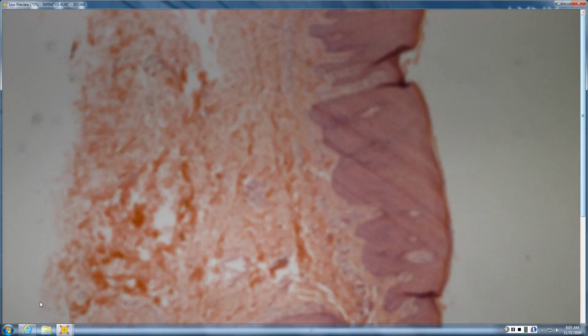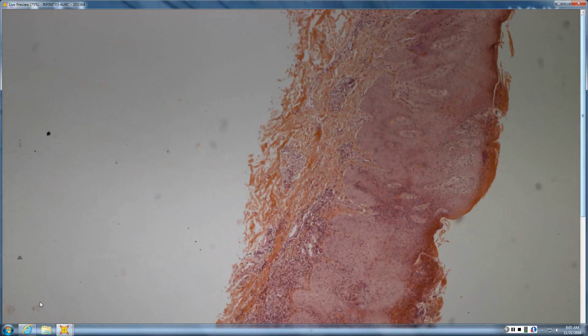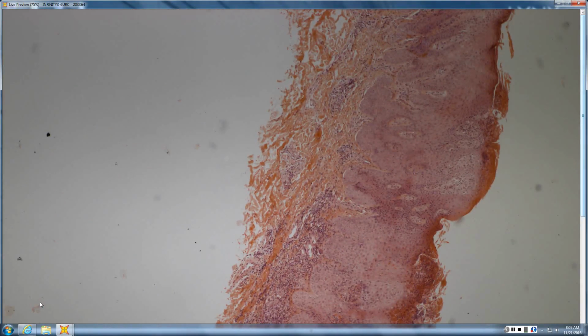Because that point is potentially tricky, an evaluation slide would usually be a little more... A perfect sarcoidosis slide for evaluation probably would not have silica in it, unless the point being made was silica granulomas. You still need to evaluate the patient. So. Okay, David.